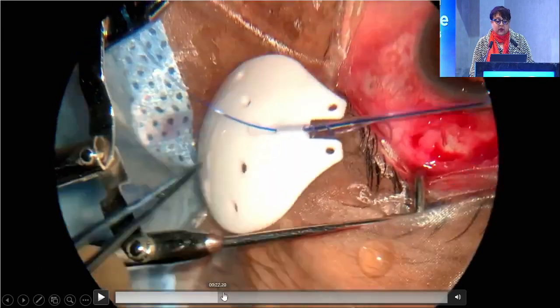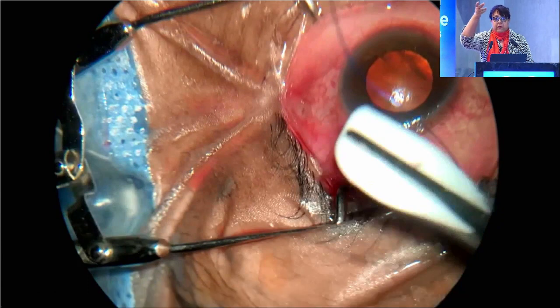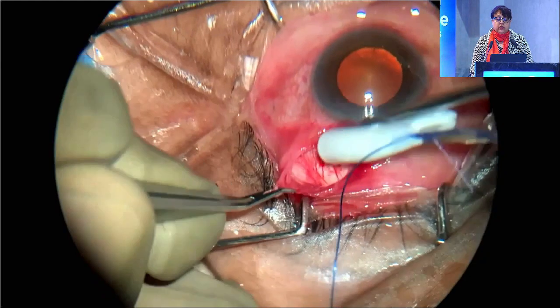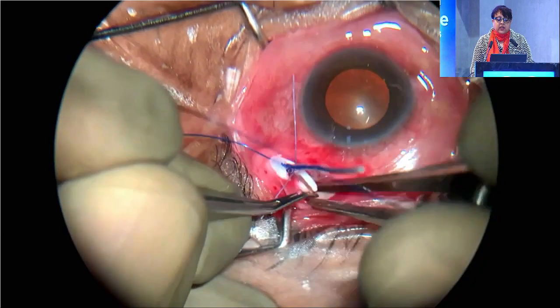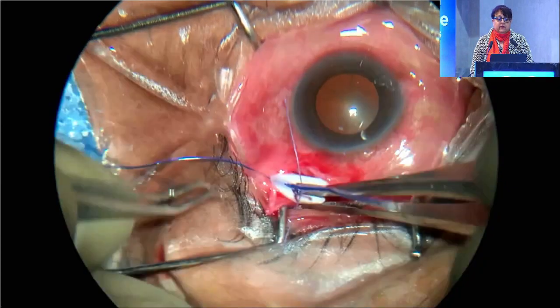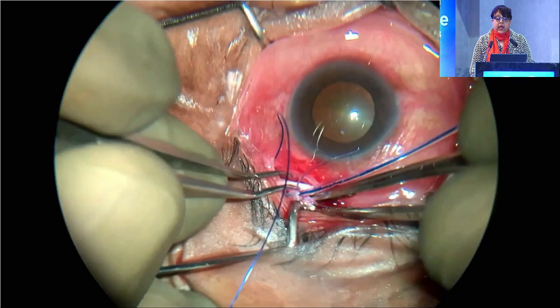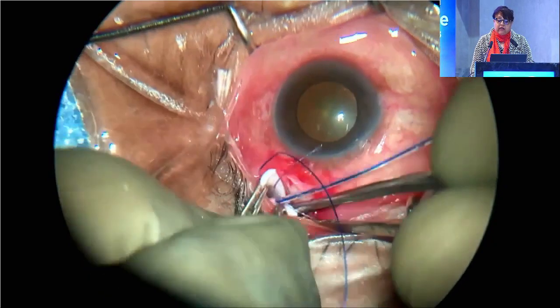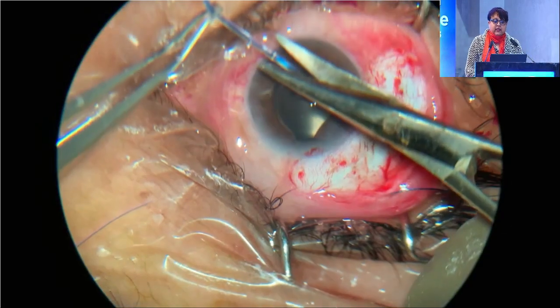Yeah, so you fold it like a taco. You fold the tube. I don't know if you remember doing foldable implants. Initially, we didn't have injectors. So you fold and you go through that 5 millimeter incision and you just let it unfold inside. And it's in between muscles. So in spite of it being a seemingly invasive surgery, very fortunately, it is not that invasive.